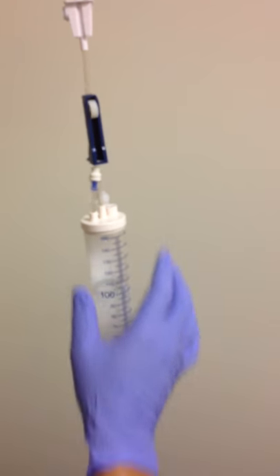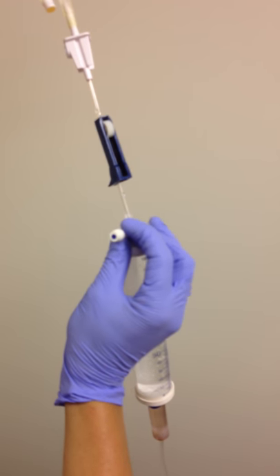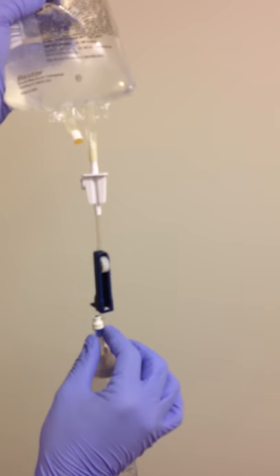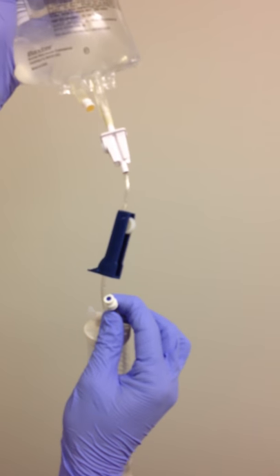Now we need to add the amiodarone. This will be the medication port. If it's yellow, it will require a needle. If it's the white and blue, it will require no needle. In this case, we'll use no needle.